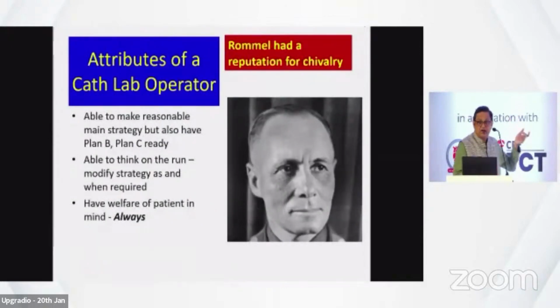Other thing is, as I already mentioned in the beginning, once you plan a difficult case, you already run the case through your mind from start to end. This is what I'm going to do, this guiding catheter I'm using, this wire I'm using, this preparation I will use, rota or not rota, I will use an imaging catheter or not, whatever. You run the whole case, and then you think that if something happens, this is my plan B. If plan B is not working, this is my plan C.